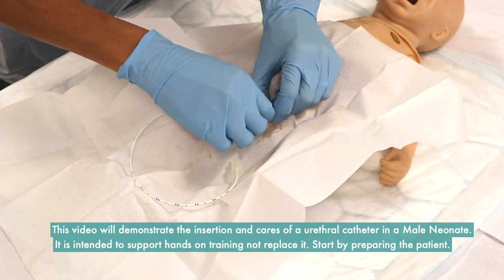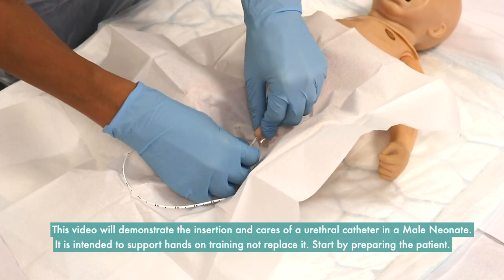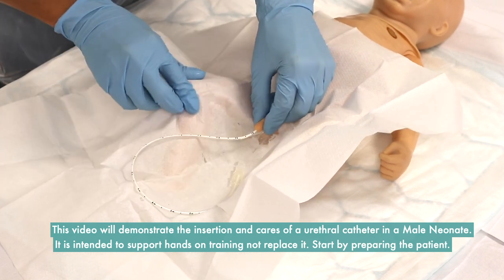Hi, I'm Alex and I'm Donna, and we are part of the urology team at Great Ormond Street Children's Hospital. Today we're going to demonstrate how to insert a urethral catheter, step by step. This video will demonstrate the insertion and care of a urethral catheter in a male neonate. It is intended to support hands-on training, not replace it.